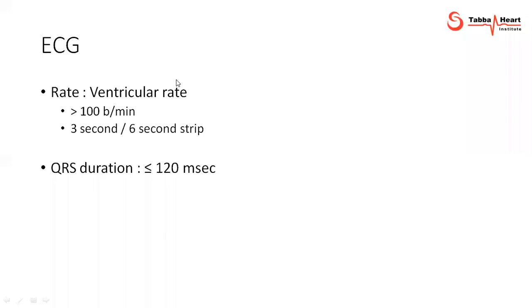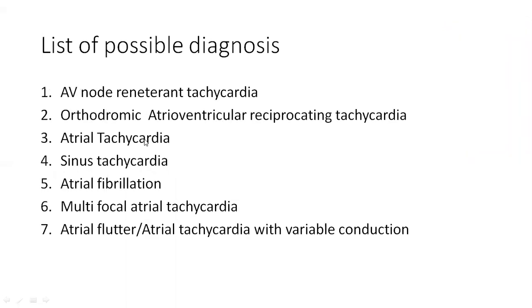So we talk about narrow complex tachycardia. We have a list of at least 7 differential diagnoses.